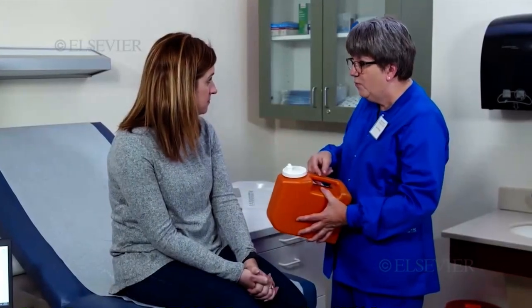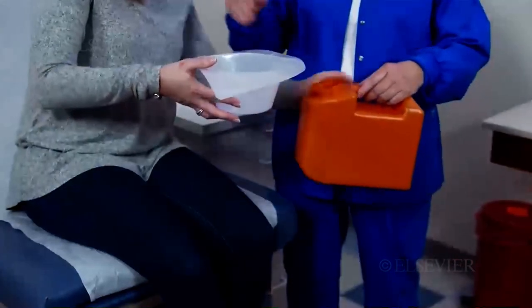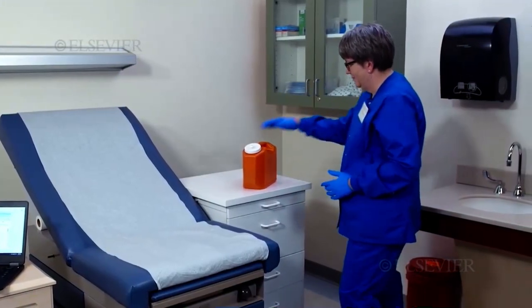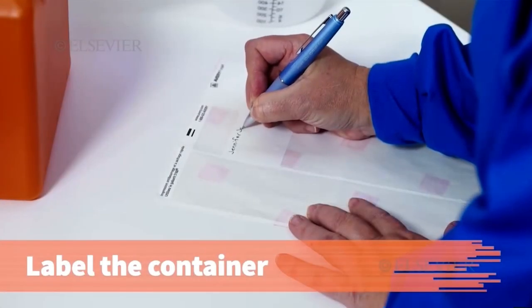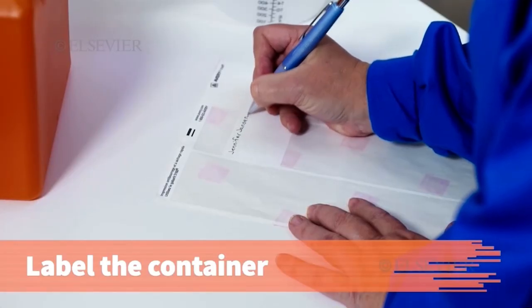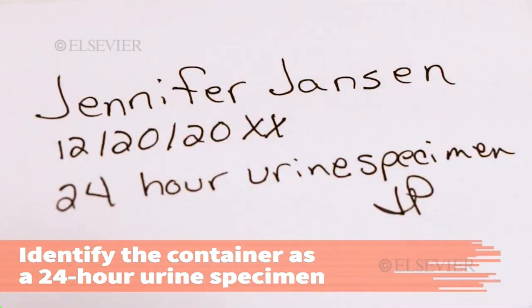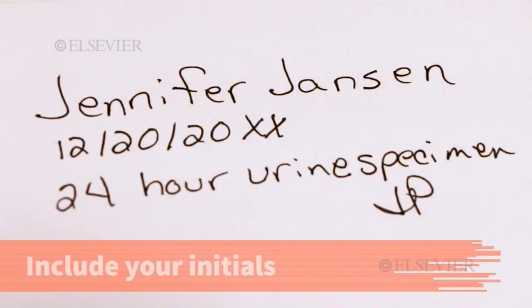In this procedure, you will learn how to instruct the patient in collecting a 24-hour urine specimen to test for creatinine clearance. To avoid a possible mix-up of specimens, label the container with the patient's name and the current date. Identify the specimen as a 24-hour urine specimen and include your initials.